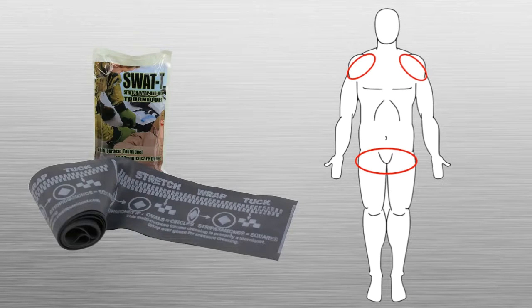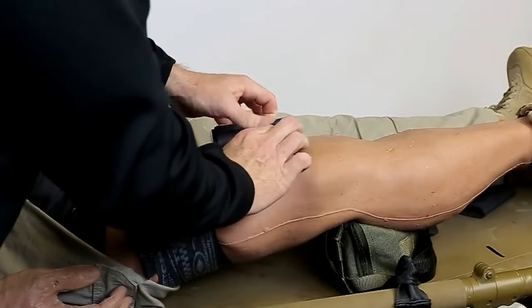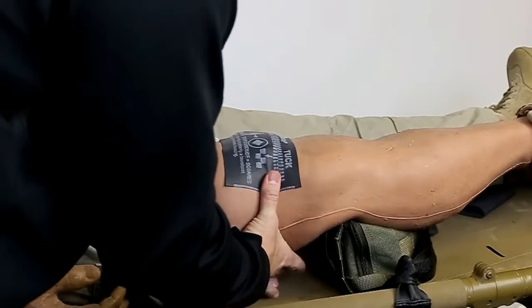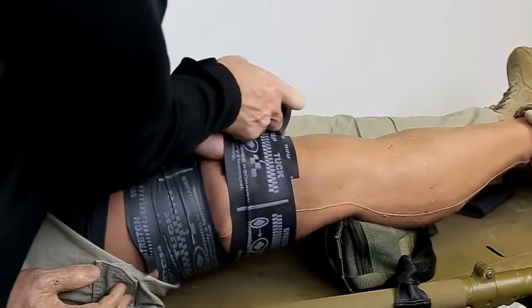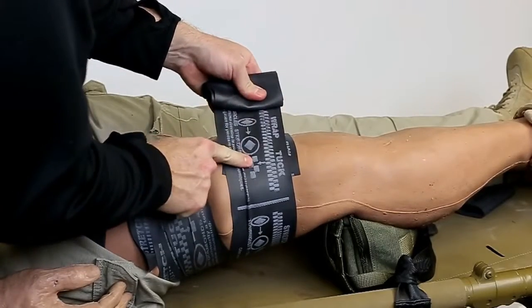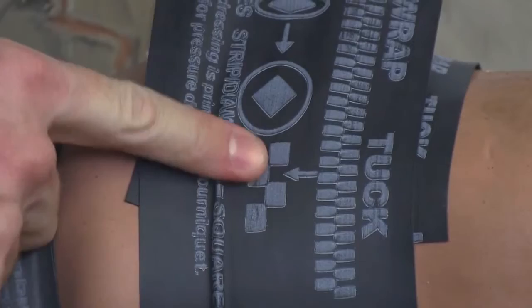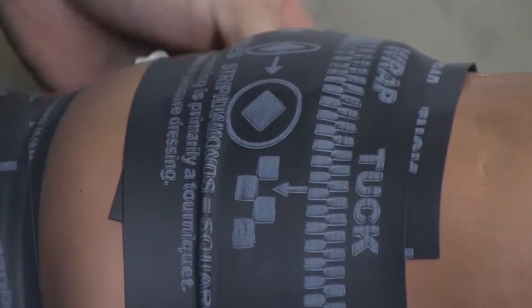Pressure dressing. Some wounds, such as those high on the arm or leg or in the groin, are not amenable to tourniquet placement. These wounds should be treated by packing with a hemostatic agent or gauze and then utilizing the SWAT-T as a pressure dressing. The purpose of the SWAT-T in this instance is to apply pressure to the packing material and to protect the wound from further contamination. Be aware of how tightly you wrap the SWAT-T in this application and check the pressure indicator markings.